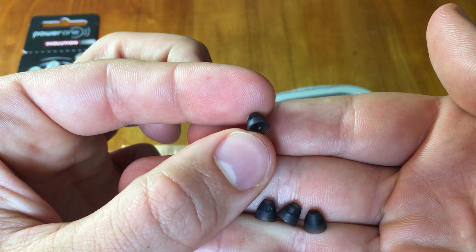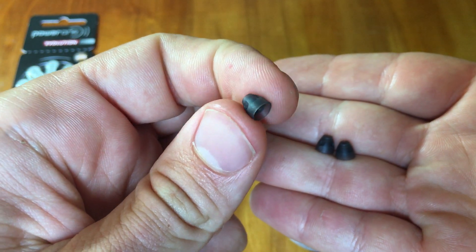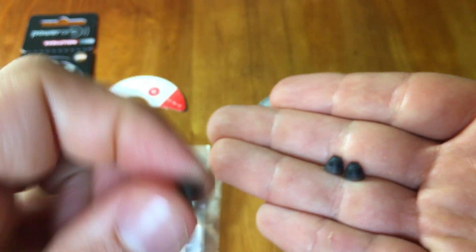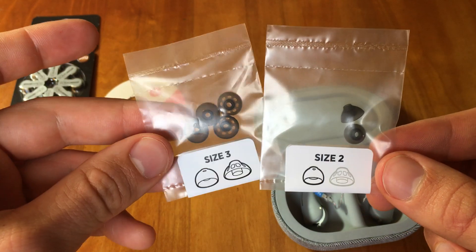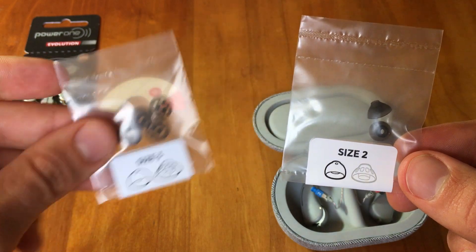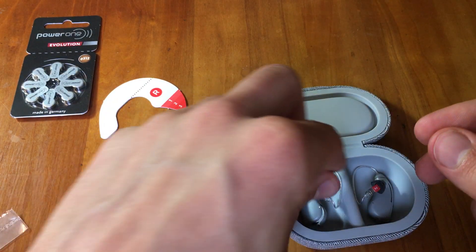This is a closed dome — you can see there are very few holes in the rubber tip piece. And then size 1, their smallest size, has one that's considered an open dome. It has openings for natural sound and air to pass through. Each size — 1, 2, or 3 — comes with an open and a closed dome. We typically advise patients to go through the different sizes and see which one fits best, something snug but not too snug and comfortable.